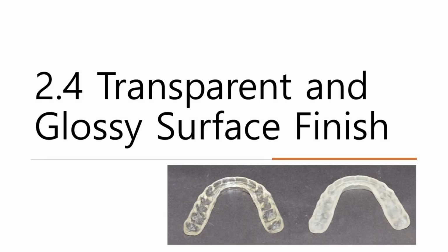Improving the transparency of 3D printed parts after post-processing, which often results in an opaque finish, involves several considerations. Techniques such as polishing, using clear coatings, or optimizing the printing and post-curing processes can enhance clarity. Material selection also plays a crucial role, as some resins are designed to yield clearer results post-curing. Adjusting printer settings for higher resolution and finer details can reduce surface roughness, contributing to a more transparent finish.